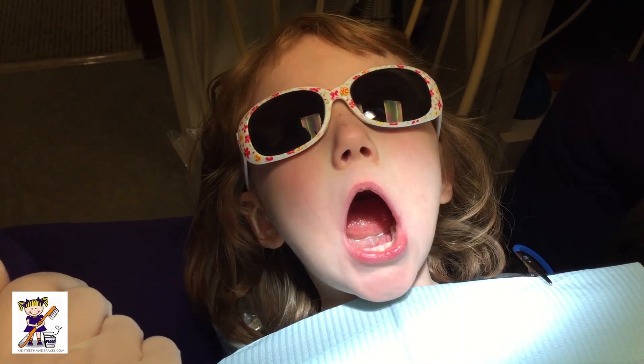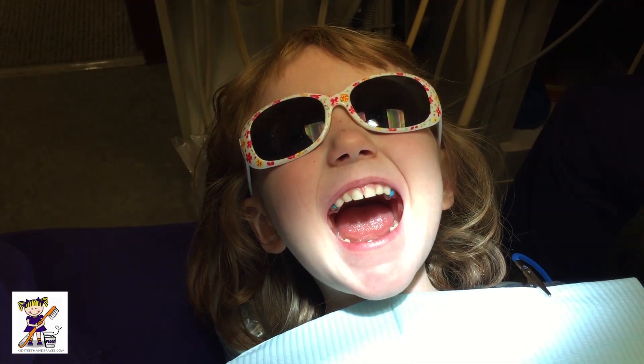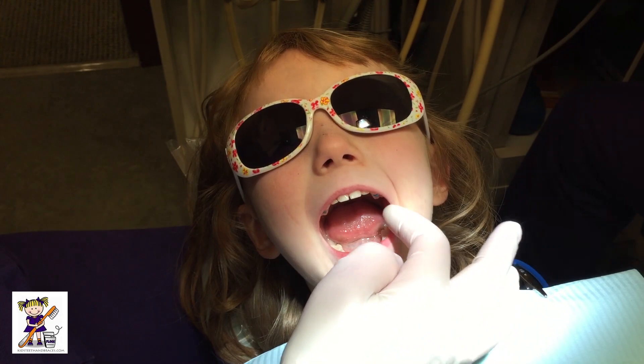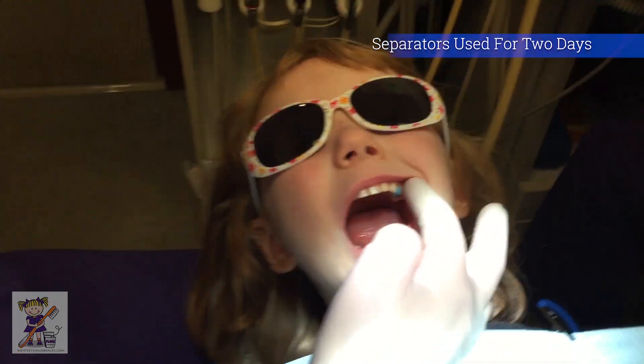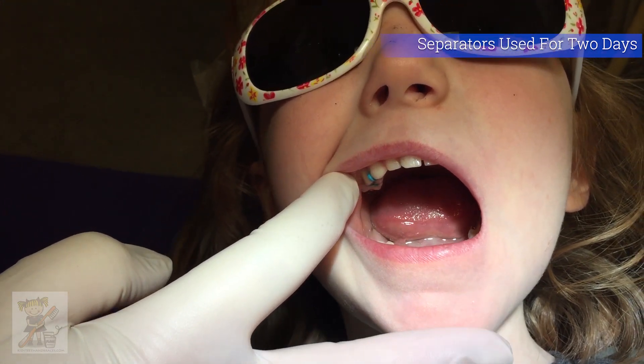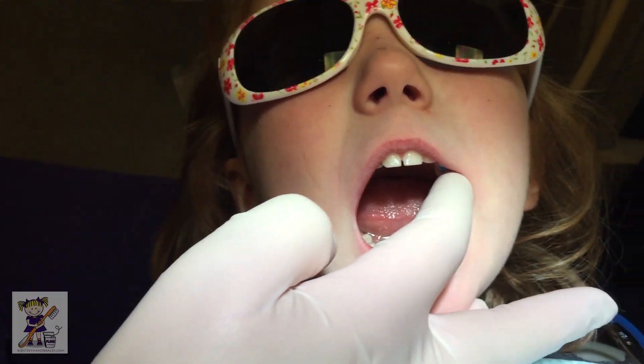All right, so my little friend is back! You lost one of your pieces of jewelry, right? So we put another one back in there because it popped out. That's where she had a little bit of space. The rest of them stayed in.